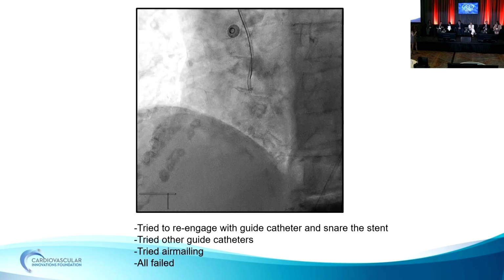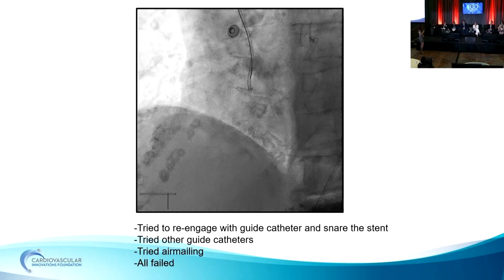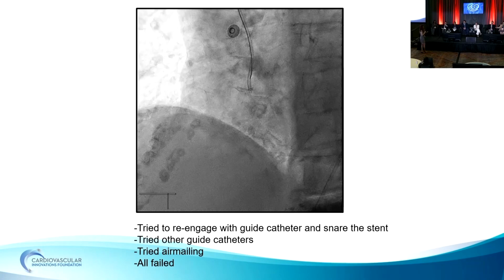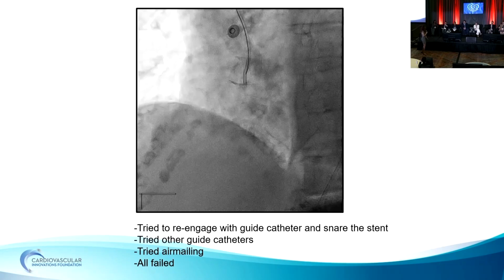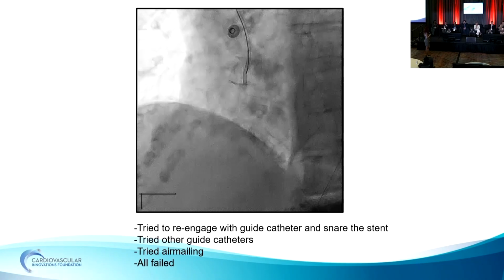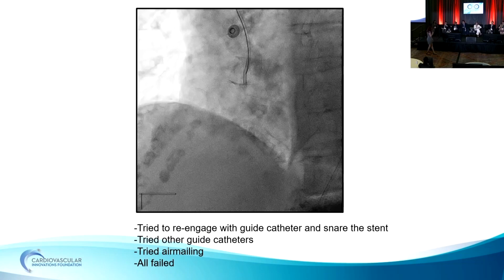Yeah, no, those are great points, and I think I underestimated the tortuosity. The lesion itself didn't look very calcified or anything, but I just underestimated the tortuosity. I think if maybe I had prepped much better in my head, probably I could have put a second wire, or as you mentioned, Catherine, a wiggle wire. It's so helpful. I've used that in so many procedures, and it really makes life easy. And I learned that from Dr. Ayer. He was my program director, my cath lab director at the time when I trained. But it's a great wire.